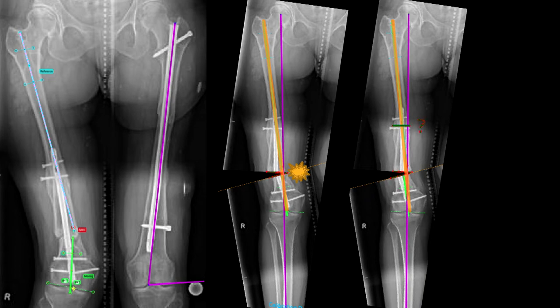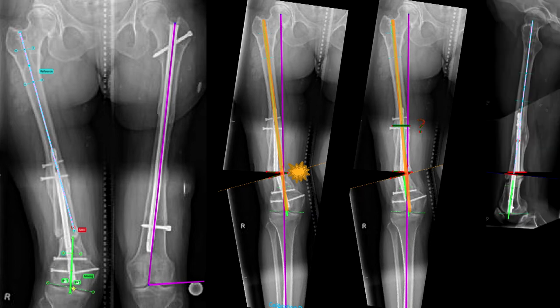We do have to be mindful, though, that in theatre, if we can't achieve the correction that we wish and treat this through a single corticotomy with an intramedullary device, and she'd been warned of this, we may have to do a second osteotomy somewhere around the other level of deformity to accommodate the passage of the nail. Make sense? And of course, we're thinking about it in more than one plane. So I didn't really foresee any particular problems in the sagittal plane.